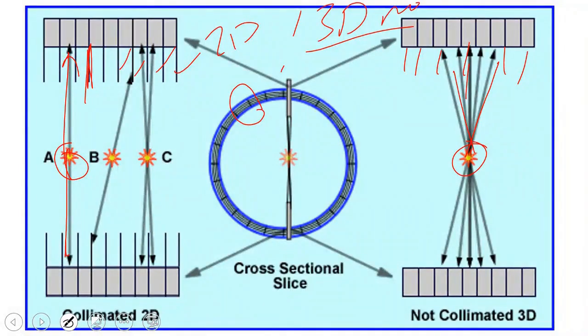But then it started to develop the idea of energy resolution and timing, the things we were talking about earlier, until it reached the topic of time of flight. We all hear about the TOF topic. What is time of flight?